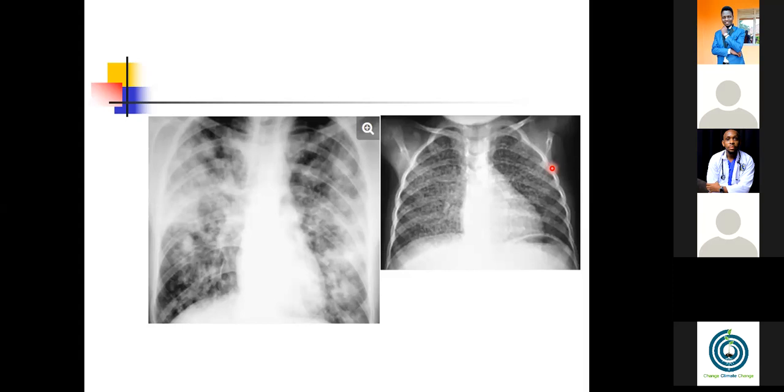Then, of course, with real pathologies, how they take up this contrast also differs. Others will take it up avidly, others moderately, others not at all. So that also helps us when it comes to getting our differential diagnosis.